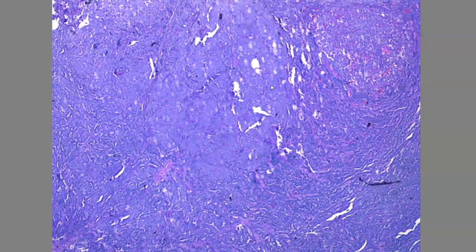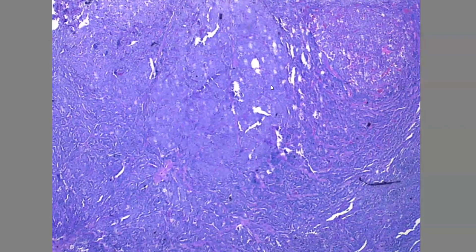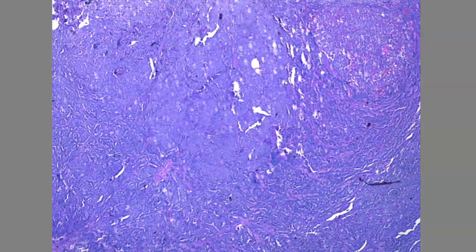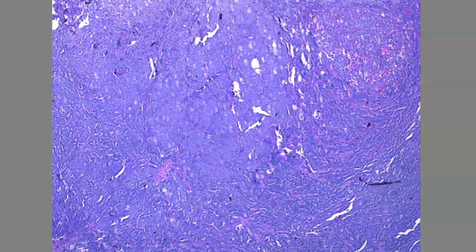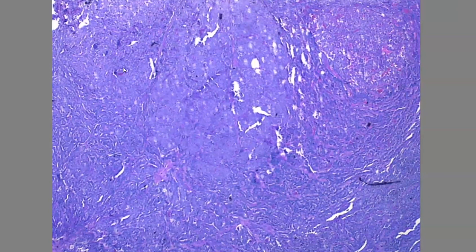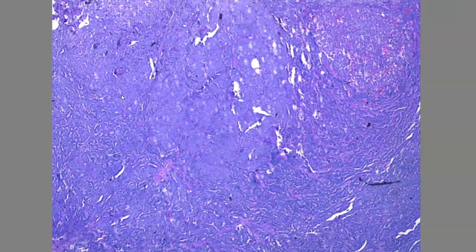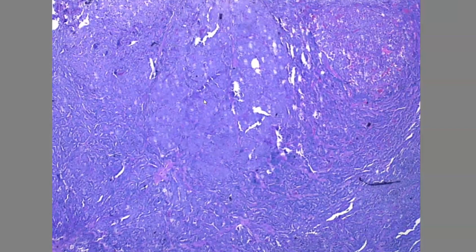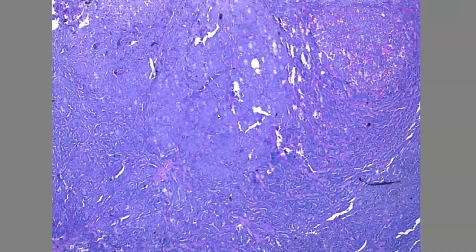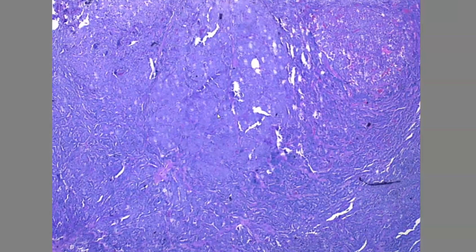The carcinoid tumor can be a central or peripheral lesion. In morphology, we are now at 2.5x magnification, and as you can see, all of this is the tumor or lesion. The pattern for these tumors can grow in trabecular, rosettes, insular, follicular arrangements, and some solid sheets can occur, as well as growth in nests.